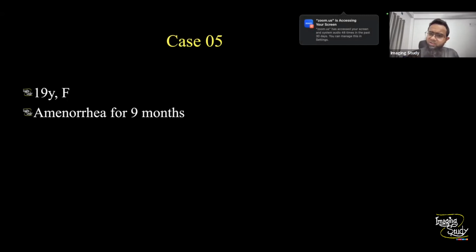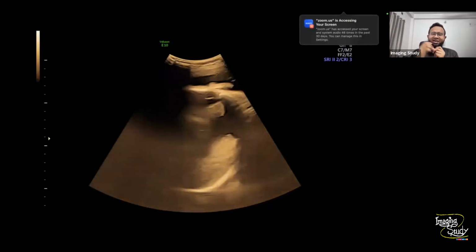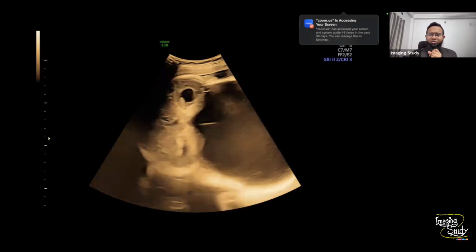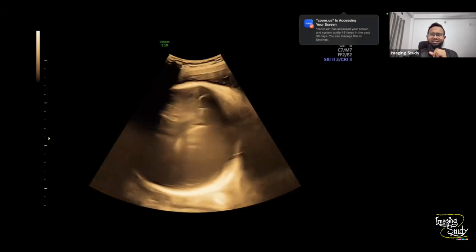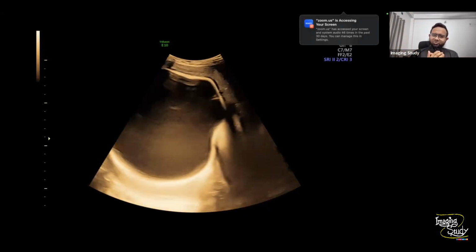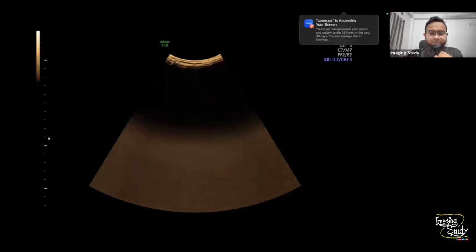So let's see what we have got on ultrasound. So here's the picture of the fetal head. Now, when you put the probe and you see this type of situation, what will be your finding? You have seen the ventricles here, but you can see a large cystic area. Now, is it the frontal aspect or is it the posterior aspect? It will make you confused. So we need to solve it, obviously.